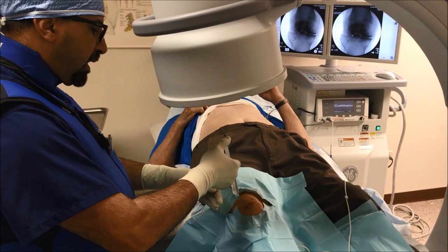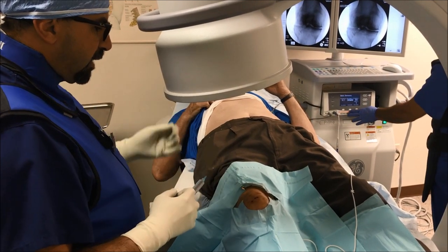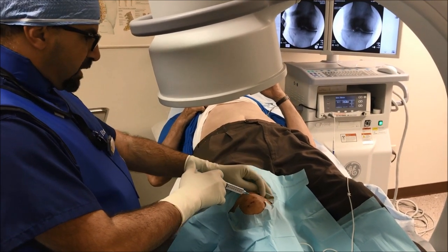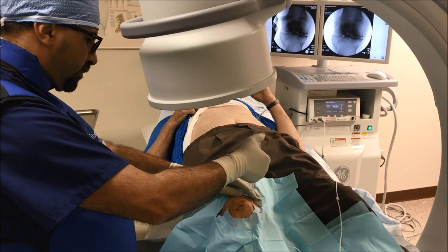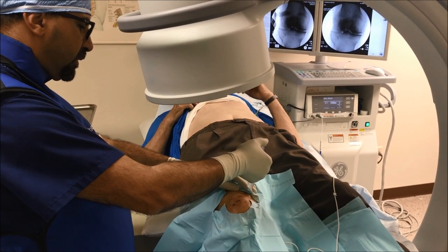Some patients may be very anxious, so we do it under conscious sedation, but otherwise it can be done under local anesthesia. If we look at the screen, you can see the needle — we are applying local anesthesia before we apply the probe for radiofrequency ablation.